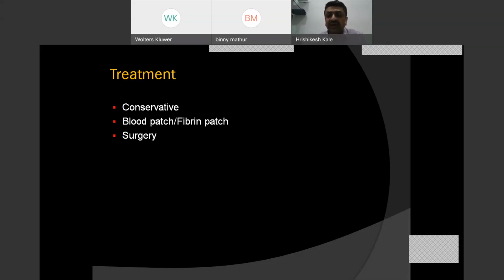The third way is, if you do localize the site of leakage, you can do what is known as a targeted CT guided blood patch placement or a fibrin patch placement. So in this, if you see say a leaking diverticulum at one of the spinal levels, you can target that with CT and then inject blood or fibrin into that area. The exact mechanism of how the blood patch or fibrin works is not definitively known. It's believed to produce an inflammatory reaction around that area and decrease leakage.